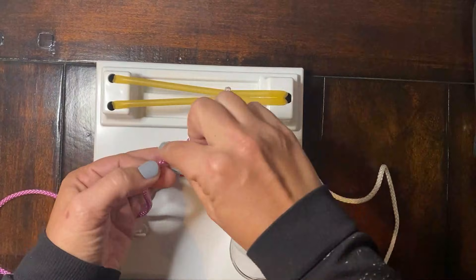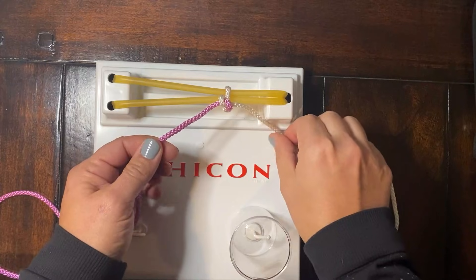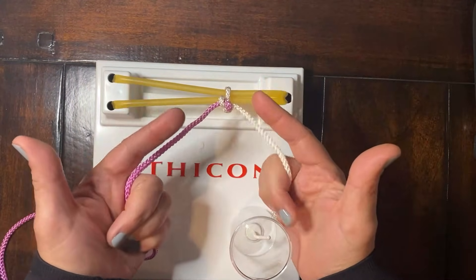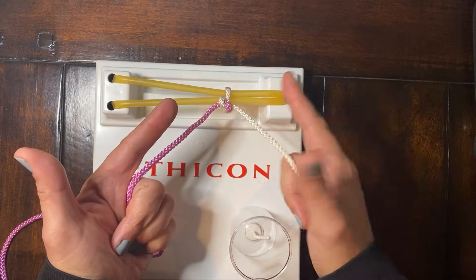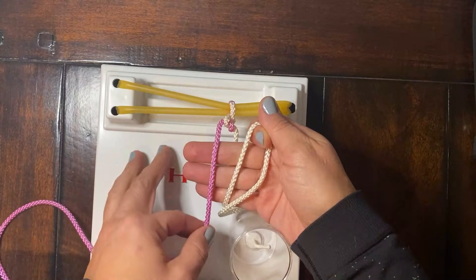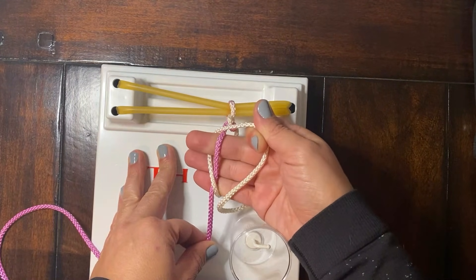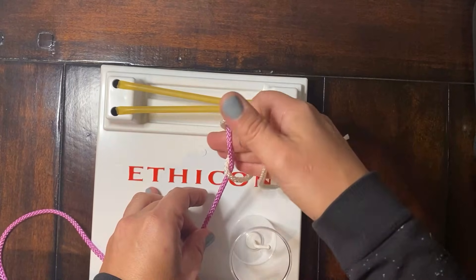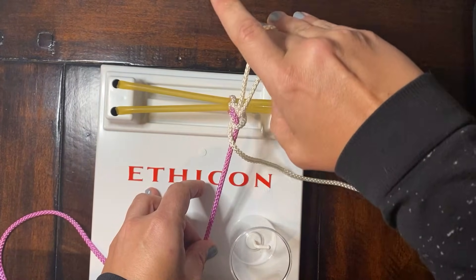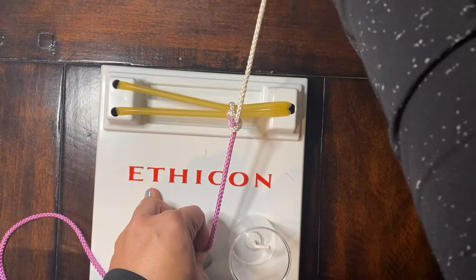The left hand stabilizes the needle end just a little bit to give us the appropriate tension. The right hand does the maneuvering. So second time, same two steps: pistol grip, pinch, chop down on the suture, lie the other end down, middle finger works first — over purple, under white — pinch here, and let go with these fingers, index and middle, index and thumb, as we pull across.